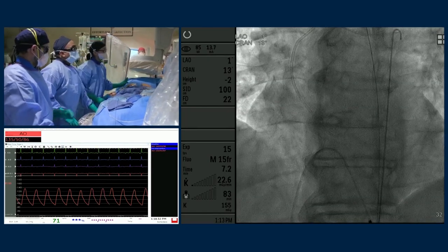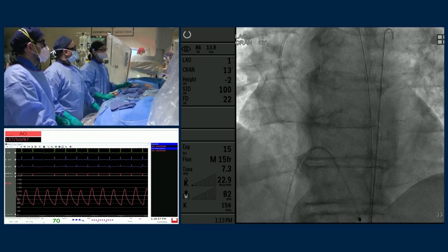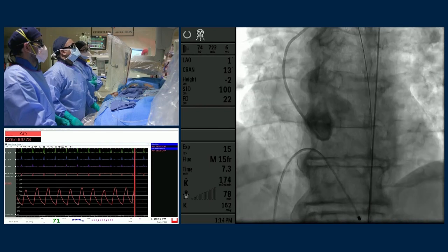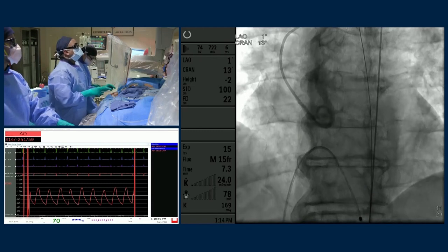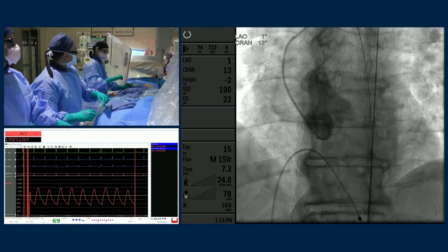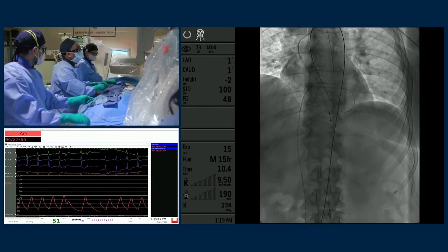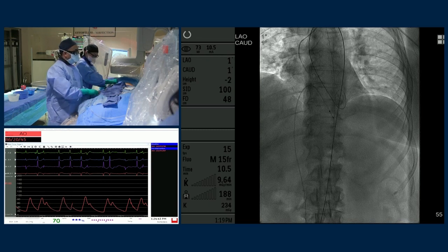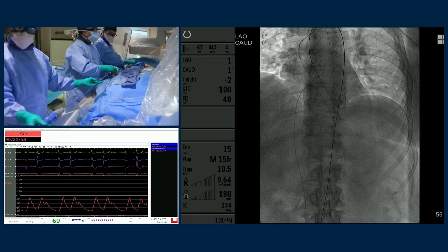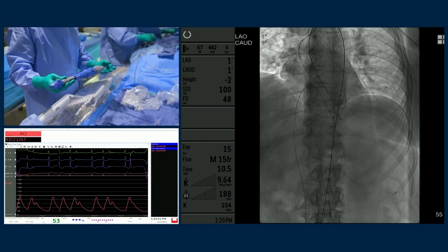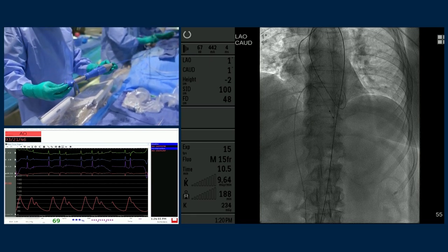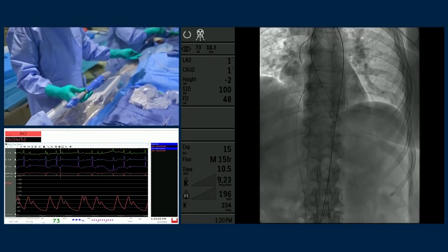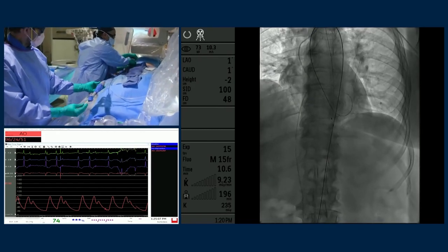Now exchanging out the sheath to proceed with the Evolute Pro Plus. An important step: the flash port is no longer held at 12 o'clock but positioned at 3 o'clock. This is what allows commissural alignment and helps keep the commissure away from the left main. Jesus demonstrates the correct flash port orientation before advancing the system.